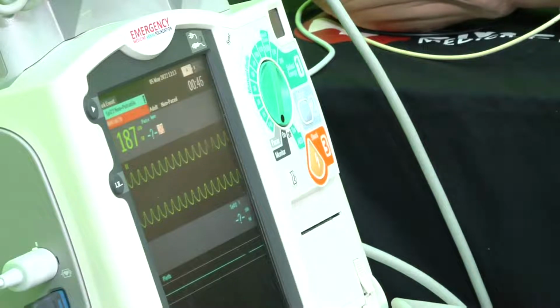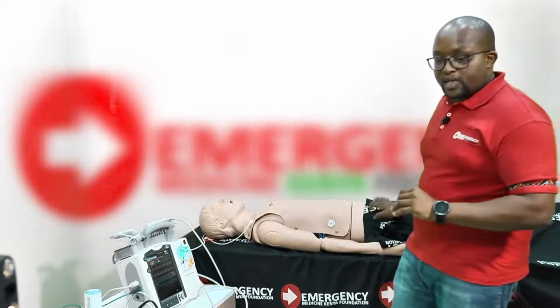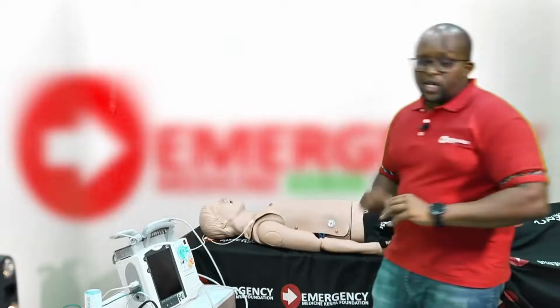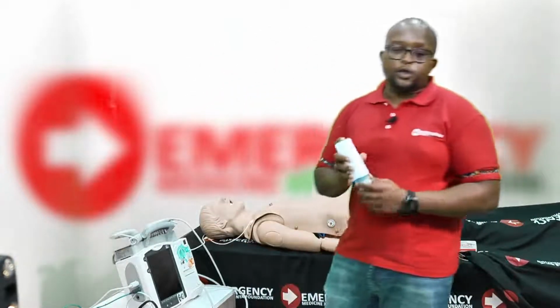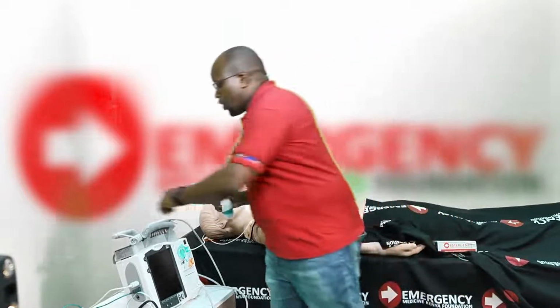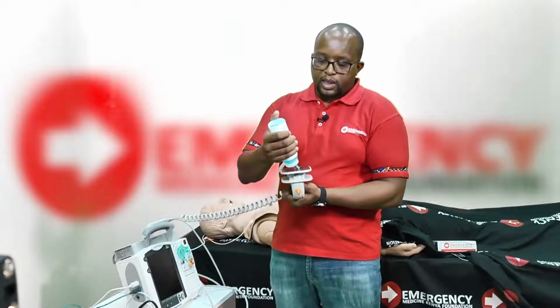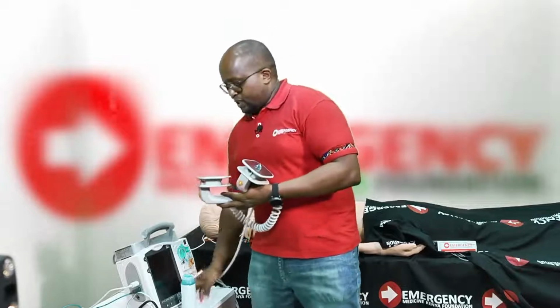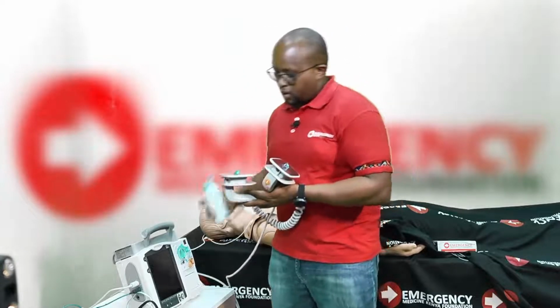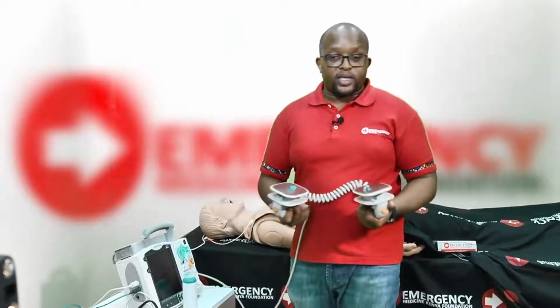Now, this is also a shockable rhythm if your patient has no pulse. So we're going to do a quick simulation. Remember, if you're using paddles, then you need to use defibrillator gel. As I said, for application of defibrillator gel, all you need to do is apply just a small blob on the paddle. And normally you'd have someone assist you, because they normally would not want you to be holding paddles. Then you place it on the patient and rub, and we're going to do this in a real-time scenario.